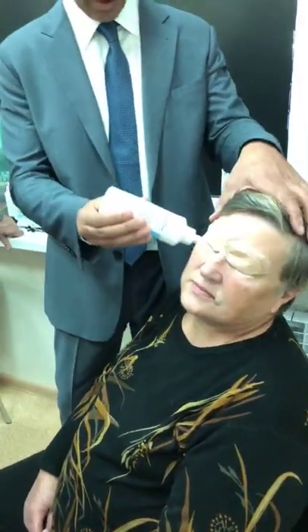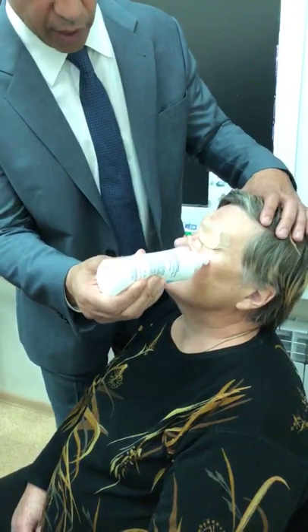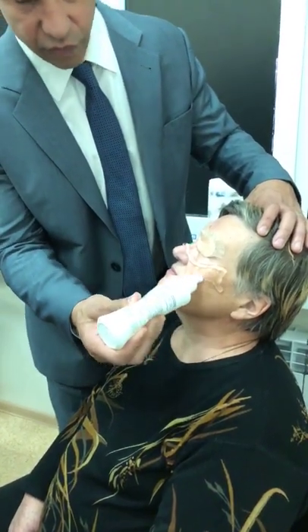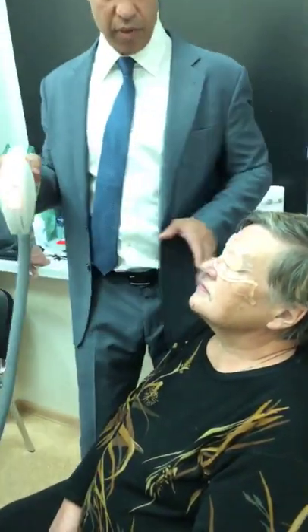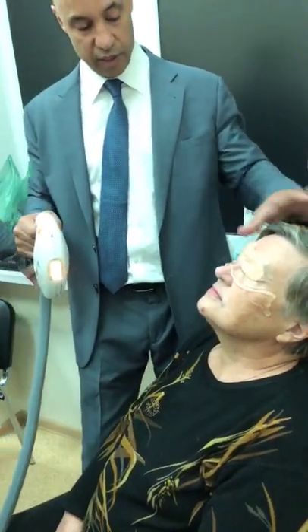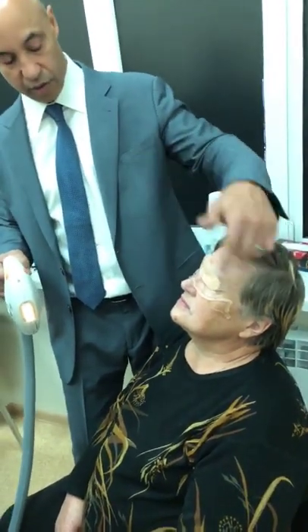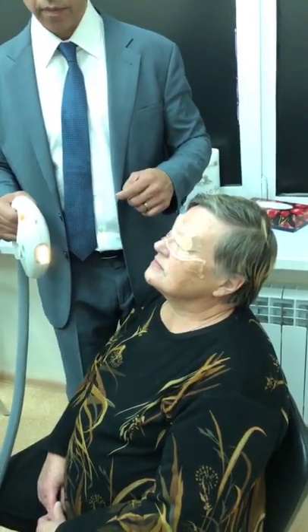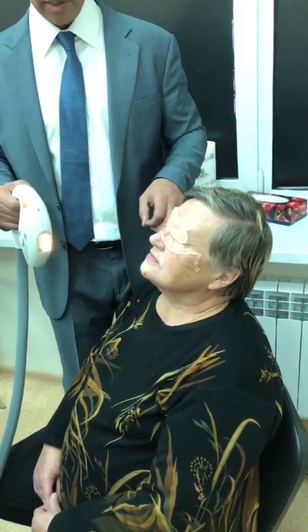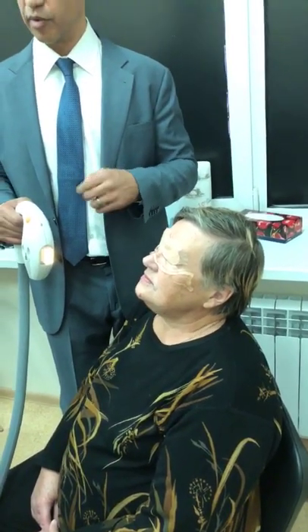Then what we want to do is use some ultrasound gel. This will direct the light to where we want, and also it'll allow me to move the glide and move the tip through the skin. So remember, we're going to treat ear to ear, and then we're going to do that twice. We're going to do that once, and then come back here and do it again. So then you're also going to tell the patient they're going to see a bright light, they're going to feel some heat, and it's going to feel like a little rubber band is hitting their skin.